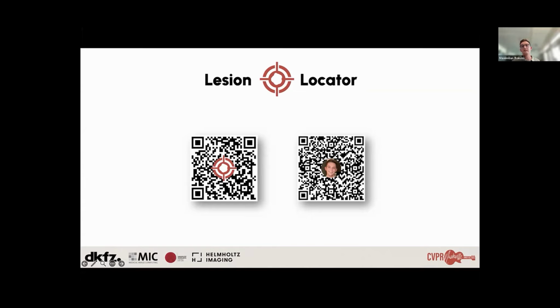So the box prompt, as I mentioned earlier, is similar to the point prompt, where you would have another channel which has the same dimension as your image, and you would place only zeros in the channel, but at the location of the box prompt, you would place ones. And this is similarly done in nnInteractive. This is basically the same thing, where we have a spatial prompt at the same location where the user placed the prompt, which is all ones, and the rest is zeros.